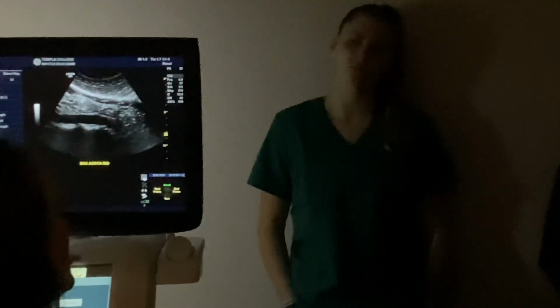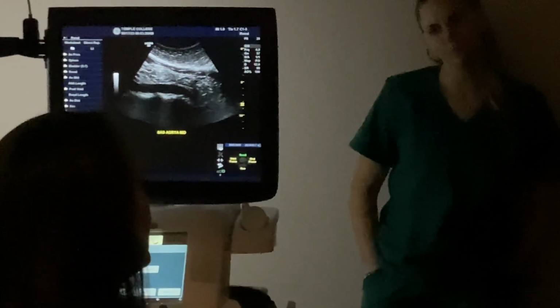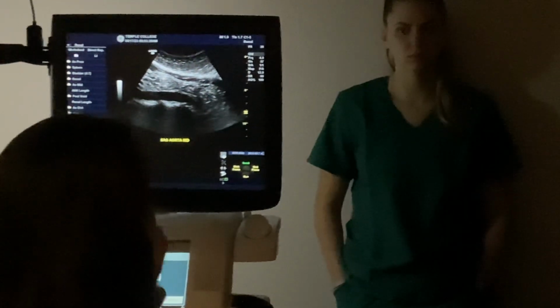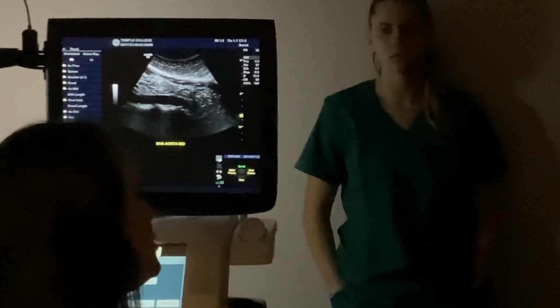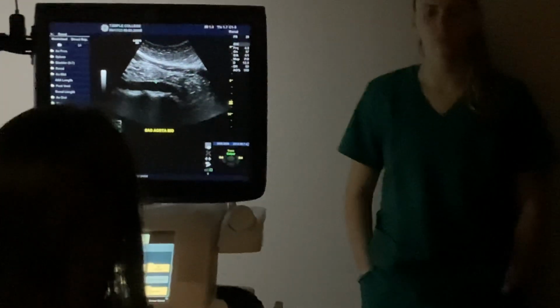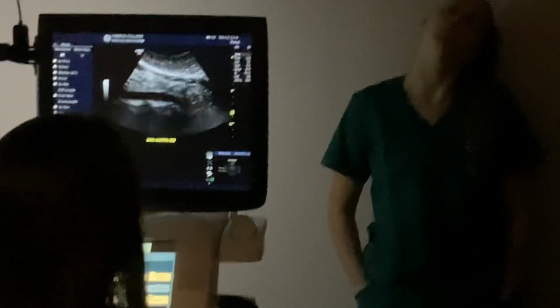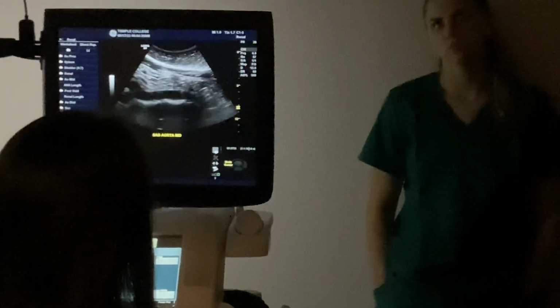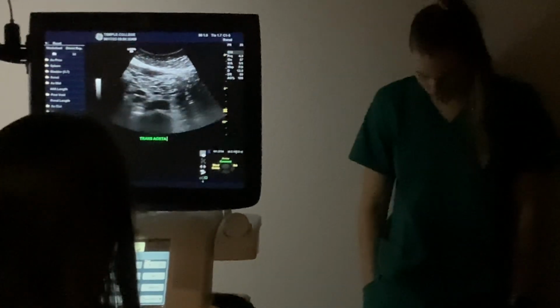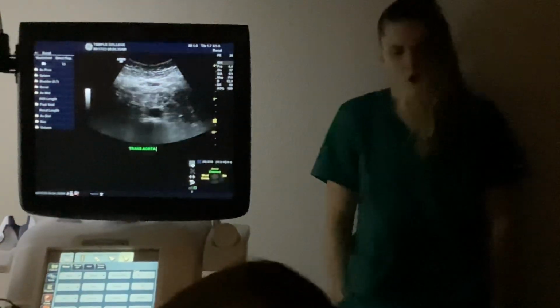Okay? When you start to do the left lobe of the liver, you'll see that too because it's right next to the heart, and the heart is making all that motion. Even with them holding their breath, it's going to cause motion. So you freeze it and then you just scooch it on back a little bit so that you can get a nice and crisp image. Okay? Same thing here, we're going to measure outer to outer. Okay? And now we can see where it's tapering down. So when we talk about doing the transverse aorta, is that what's next, or did I go into bifurcations?